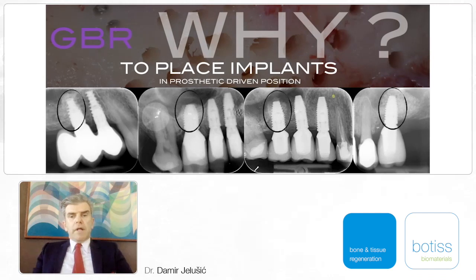Most of the implants are single implants for single crowns, and on the left-hand side you can see 2 implants for a small span bridge with 1 cantilever, just to avoid the necessity for a lateral window approach and a sinus lift.